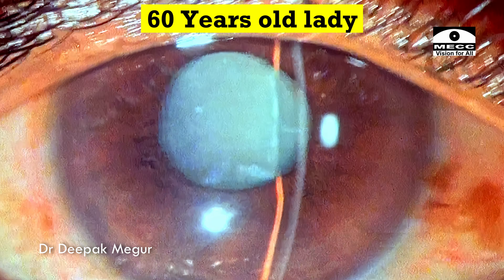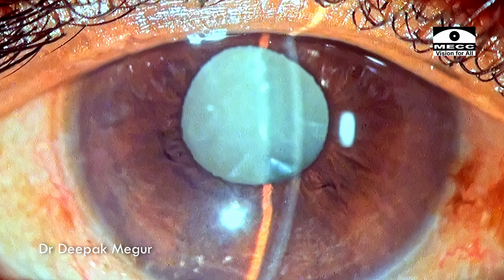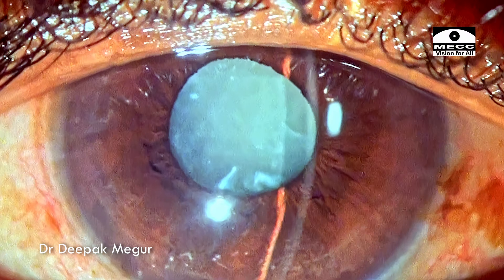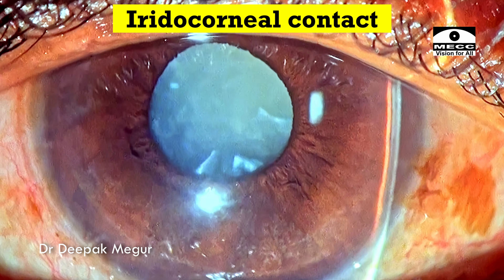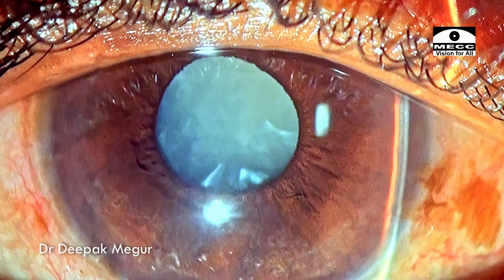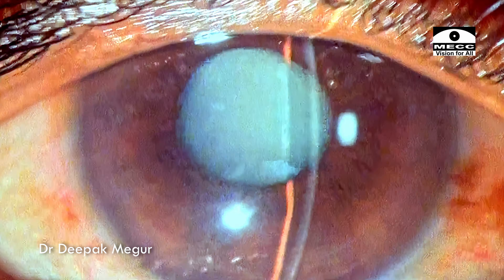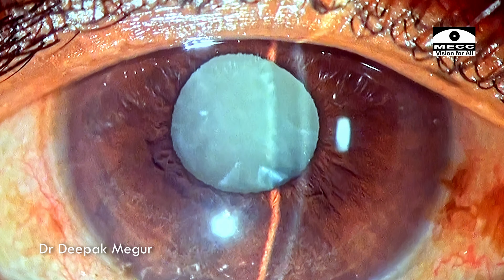She is a 60-year-old lady who has this intumescent lens. The interesting aspect is that the central anterior chamber depth documented by biometry is just around 1.8. As the slit beam traverses to the mid-peripheral region of the anterior chamber, we can see the iridocorneal contact. We haven't dilated the pupil because we're worried about this patient developing a phacomorphic lens-induced glaucoma, and we want to start the patient on IV mannitol and then put in dilating drops before we take the patient to the OR.